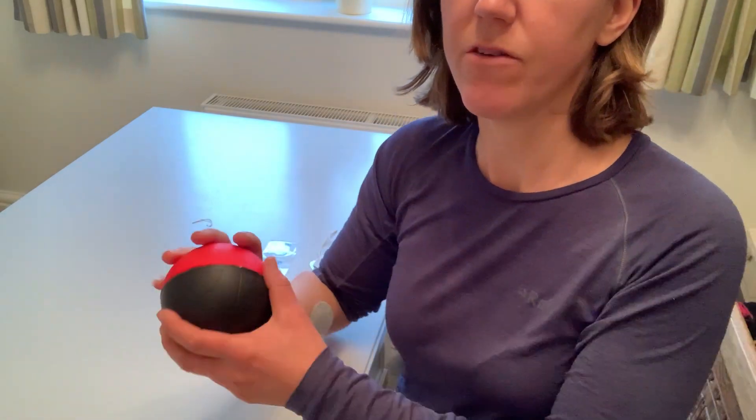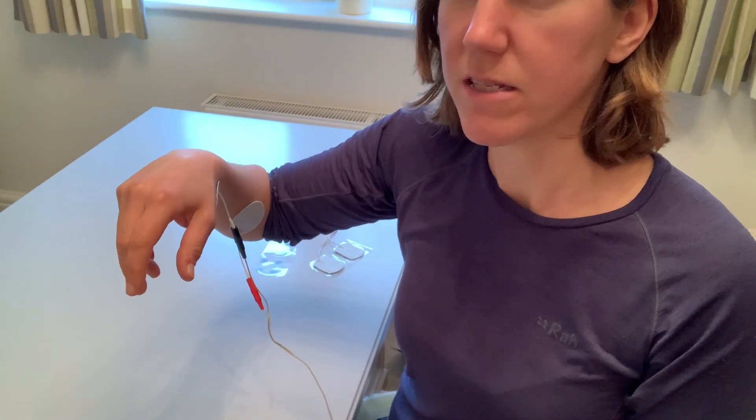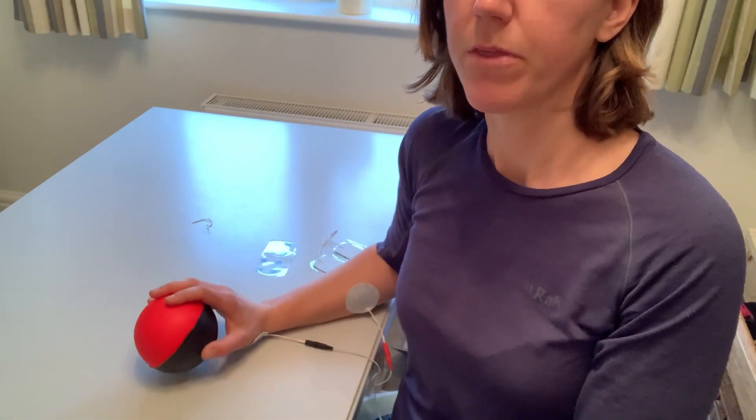Top tip: if you've got a tendency for the stimulation to cause your wrist to bend, ideally we'd want the wrist in an extended position to keep the muscle nice and long. So if I have the ball on the table — it could be a rolled towel, a water bottle, or a sports bottle — it's going to keep my wrist in a nice position, and I can feel the stimulation coming in to close around the ball.